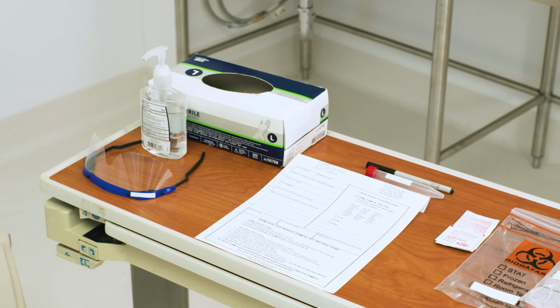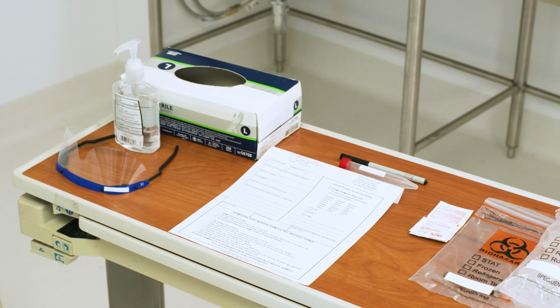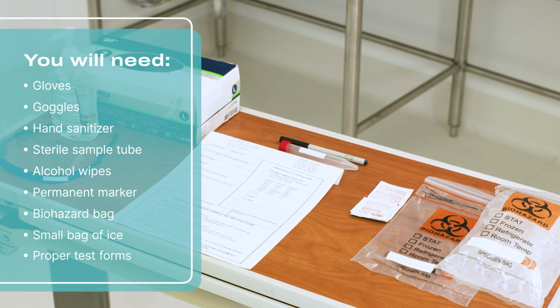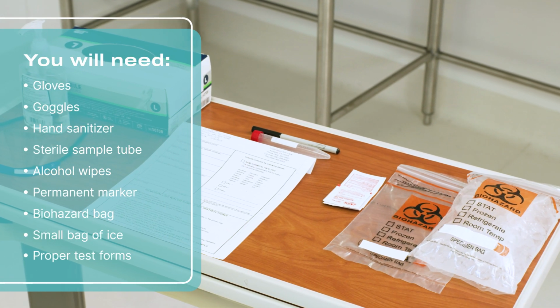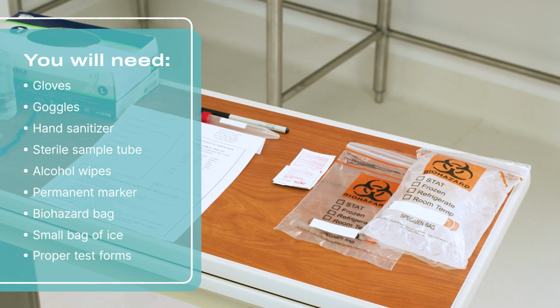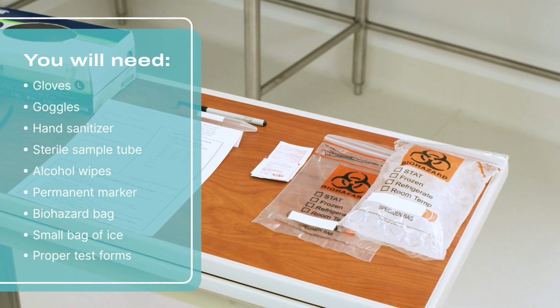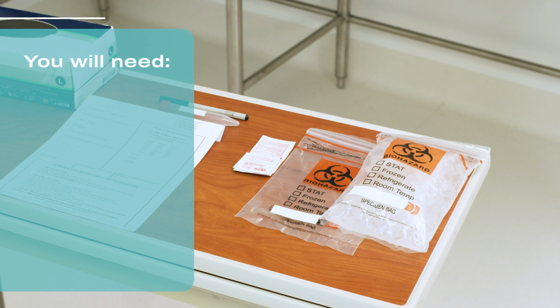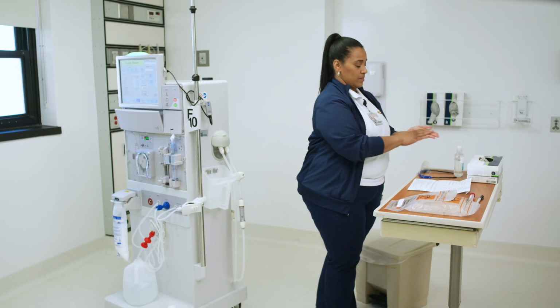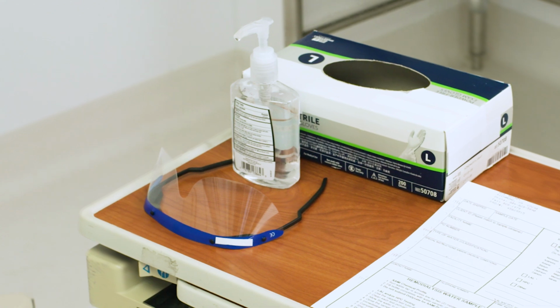Before testing, take a moment to gather all necessary supplies. You will need gloves, goggles, hand sanitizer, sterile sample tube, alcohol wipes, permanent marker, biohazard bag, small bag of ice, proper testing forms. Once you've gathered your supplies, perform hand hygiene, don goggles and gloves.